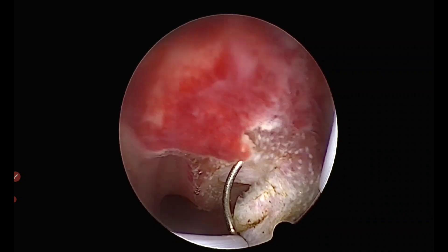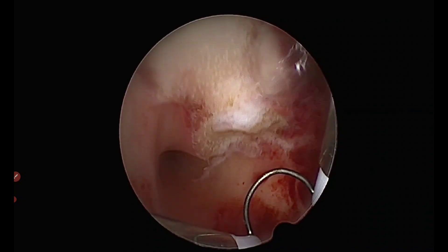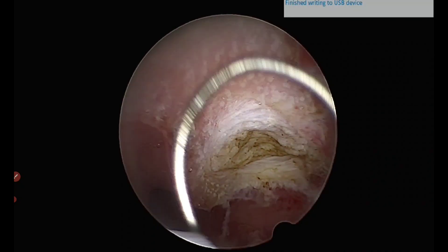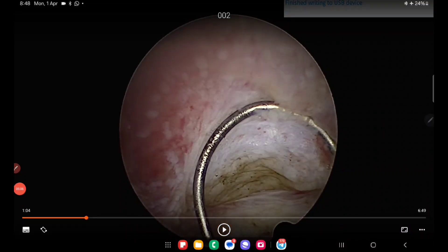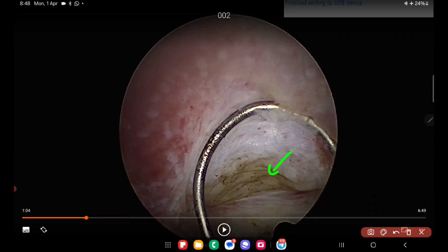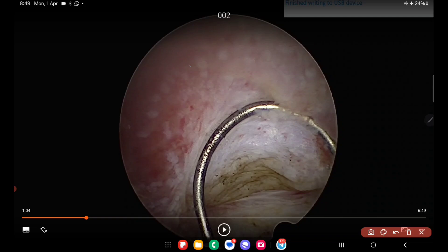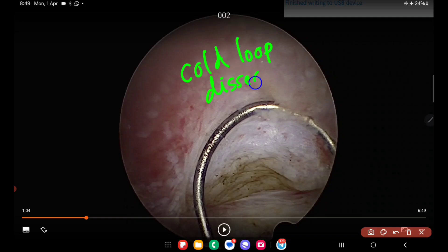Moving to the actual surgery: I am taking small strips of tissue from the fibroid, starting from the fundus and moving downward. The loop is activated and pulled towards the surgeon — we do not push away. The clear differentiation between the fibroid and the myometrium is visible: the fibroid tissue is more whitish while the myometrium is more pinkish. Part of the fibroid has already been shaved off; now we proceed with what is called cold loop dissection.